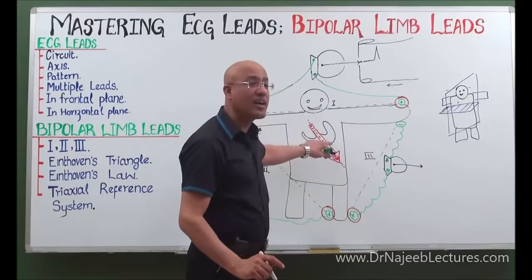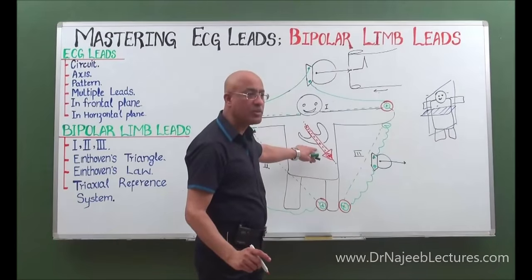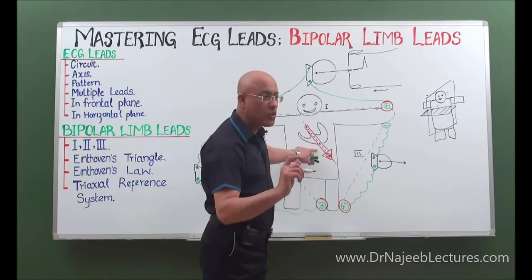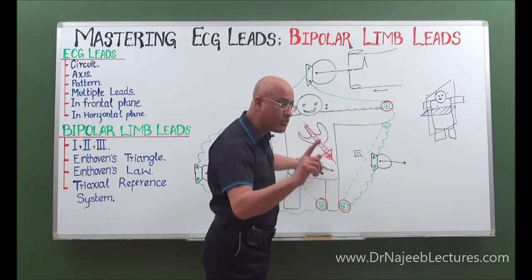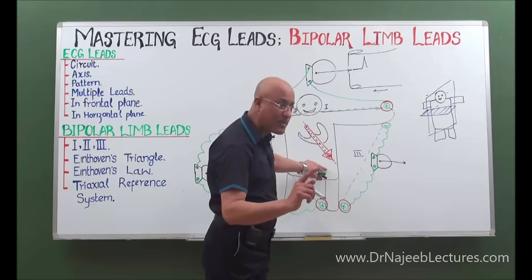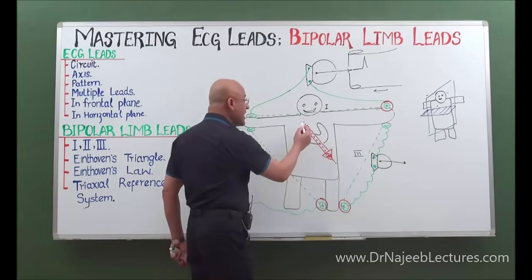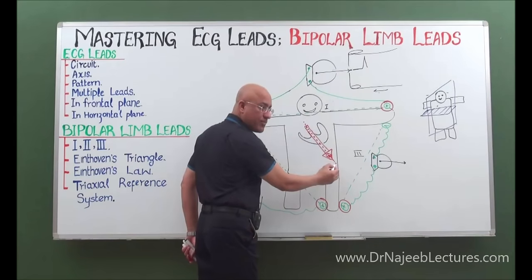This is the axis of the cardiac vector, to be very specific, because this is major ventricular depolarization, right? Or ventricular depolarization vector, mean QRS vector. So here I'm showing this mean QRS vector, which represents ventricular depolarization. Its vector moves down and left in the frontal plane. So this vector has its own axis. The electrical axis of this ventricular depolarization is down and left.